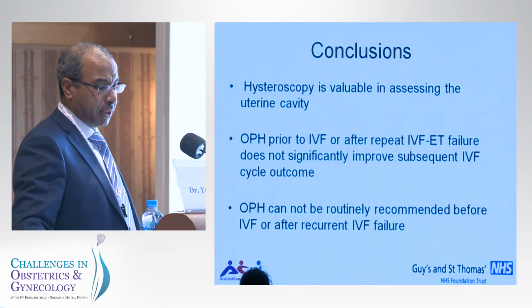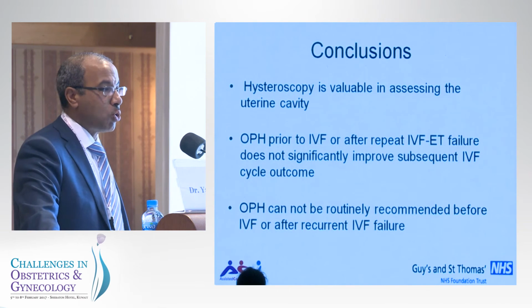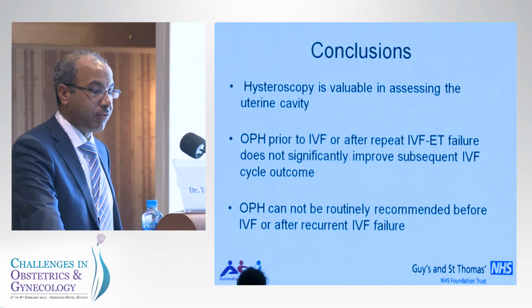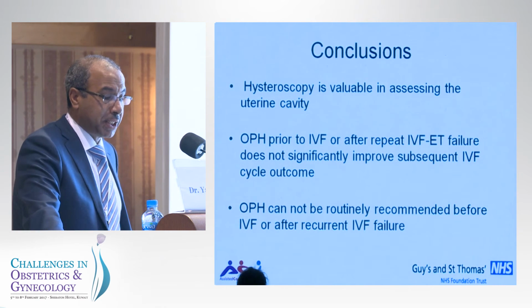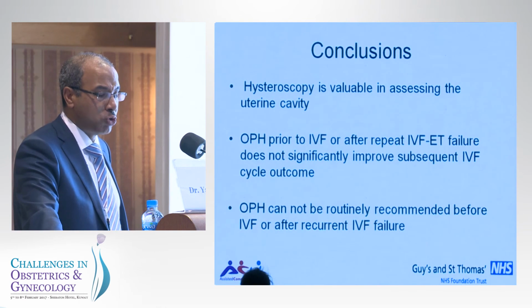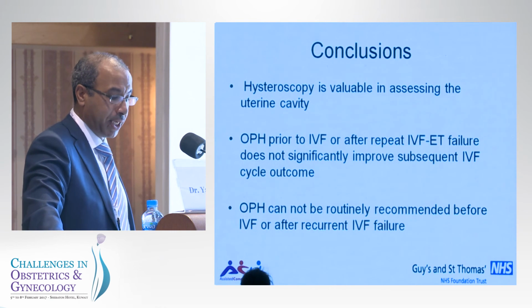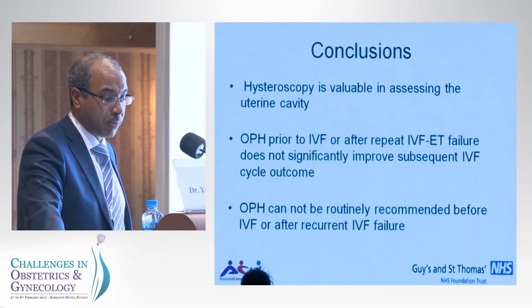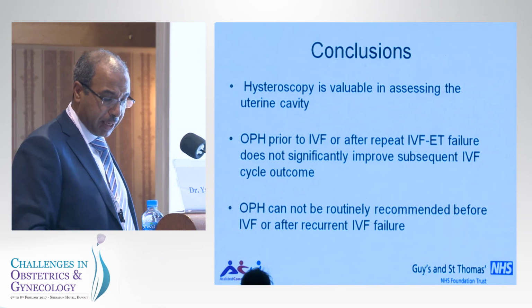So the conclusion that I can share with you after this talk is that hysteroscopy is no doubt a valuable tool in assessing the uterine cavity. Outpatient hysteroscopy before IVF or after recurrent implantation failure does not significantly improve subsequent IVF outcome as a routine, and outpatient hysteroscopy cannot be routinely recommended before IVF or after recurrent implantation failure.